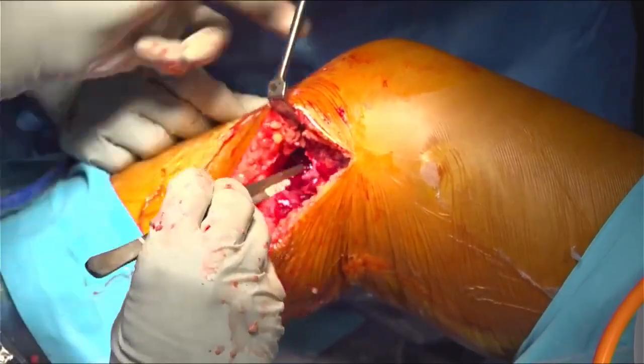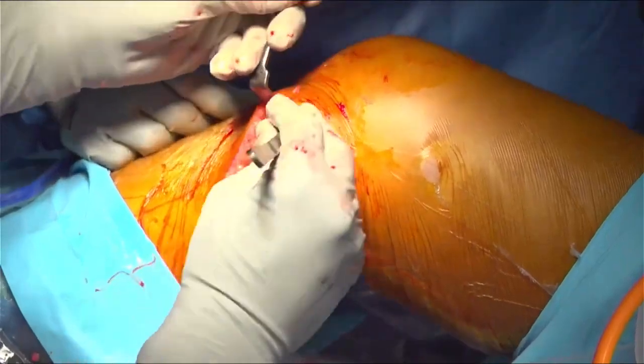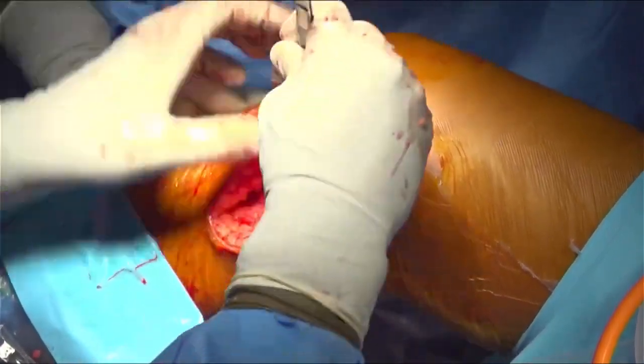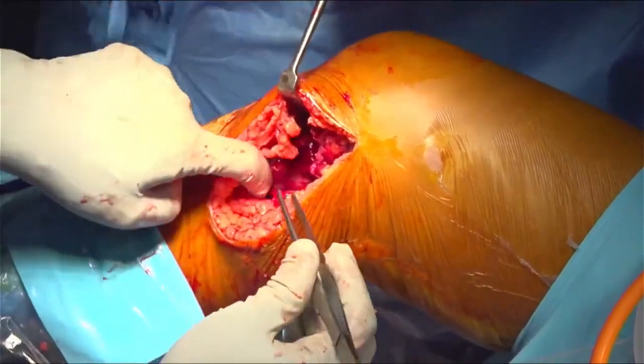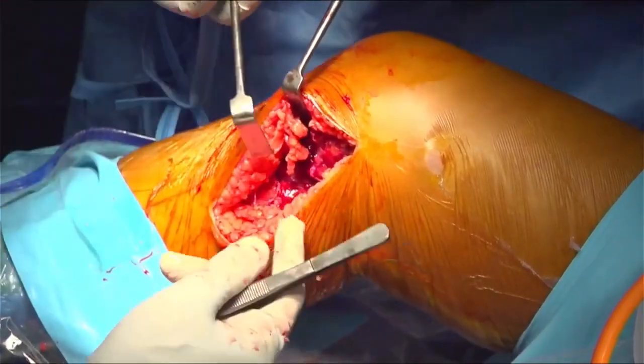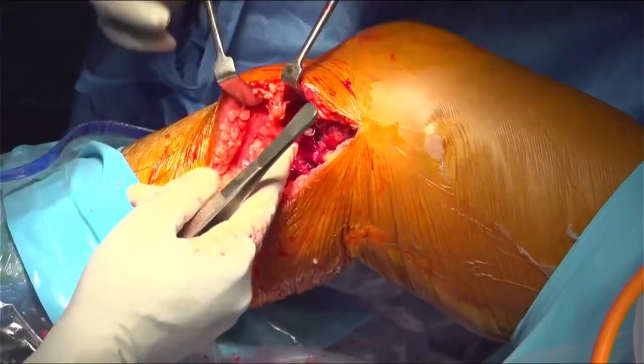5.5 mm PEEK anchors. 5.5 mm PEEK anchor please.